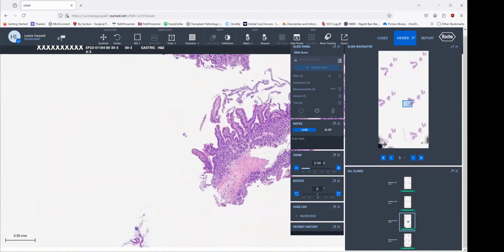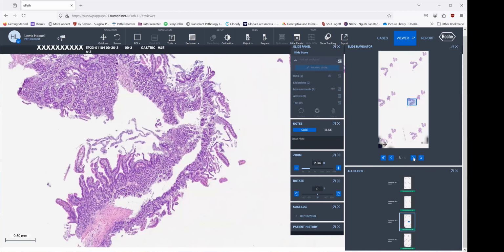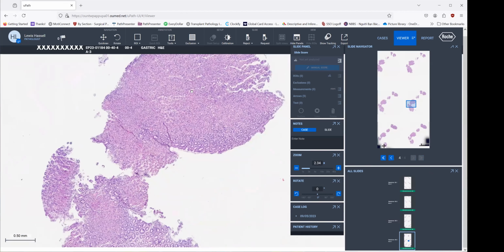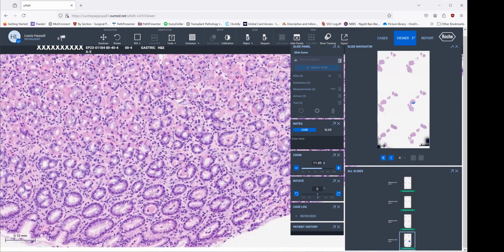their evaluation. So here's her duodenum. This was spared, and then what else did we get here? Here's her stomach, and I think this was spared. So we had rectum, colon, and so forth.